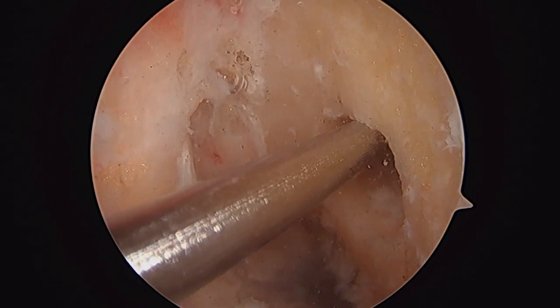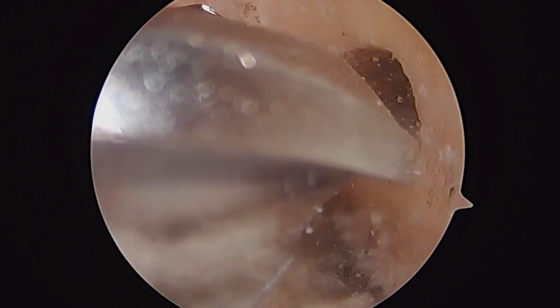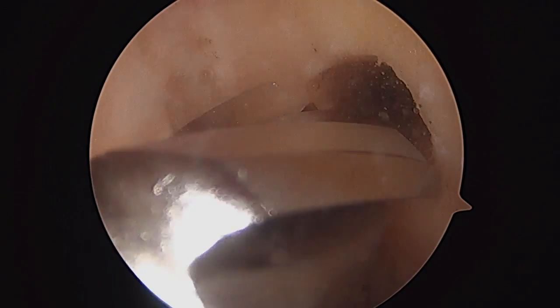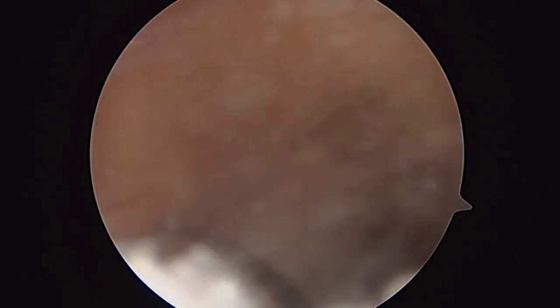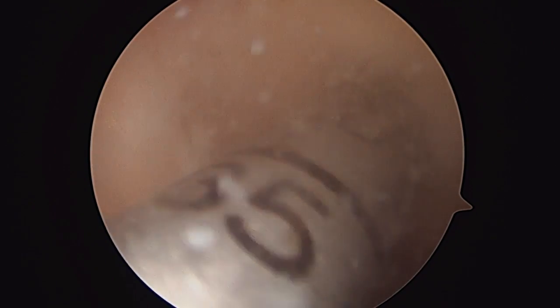So if I don't like the back wall, if it's too thin, I can drill more influenced anteriorly to avoid that back wall blowout. If I like where it is centrally, I can take maybe another millimeter from the back, which I'm doing in this case. I don't want to take as much back wall as the drilling will allow me. I'm keeping the pin fairly centrally in this case, but it allows you that freedom.